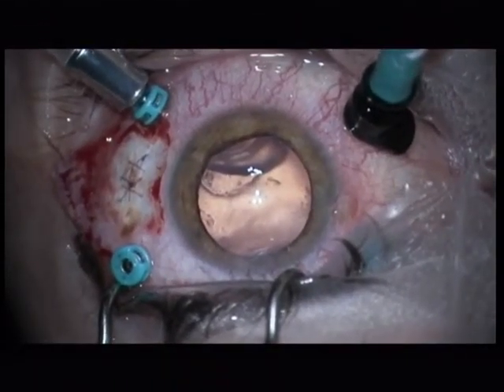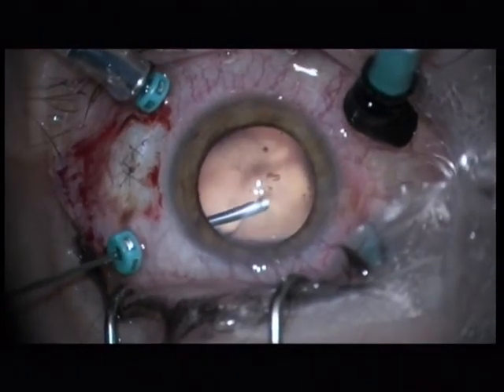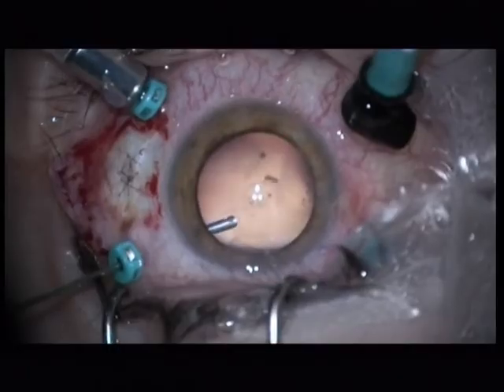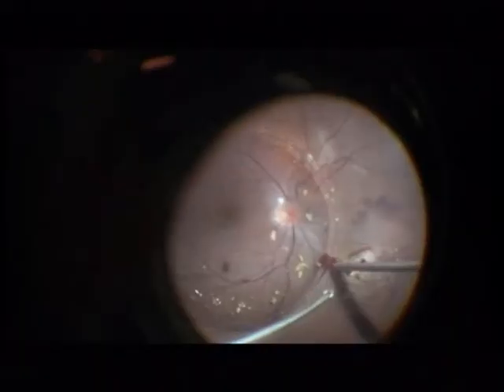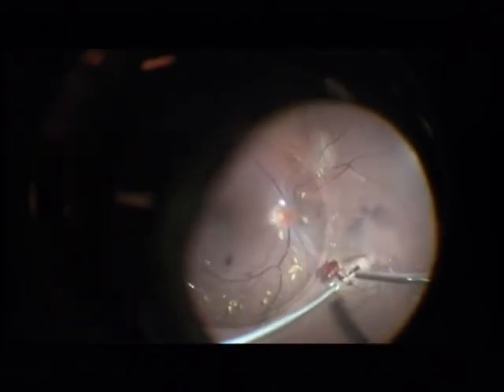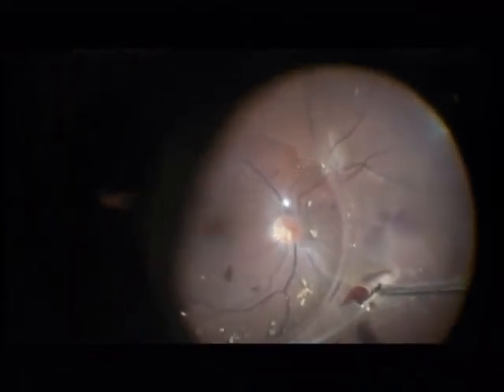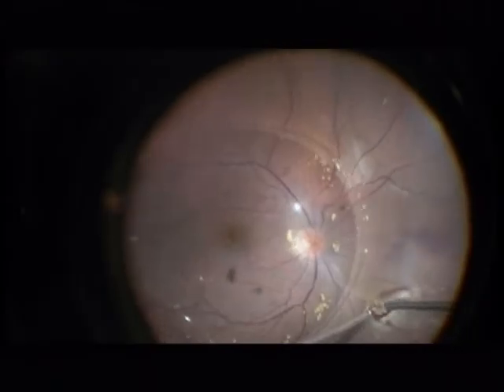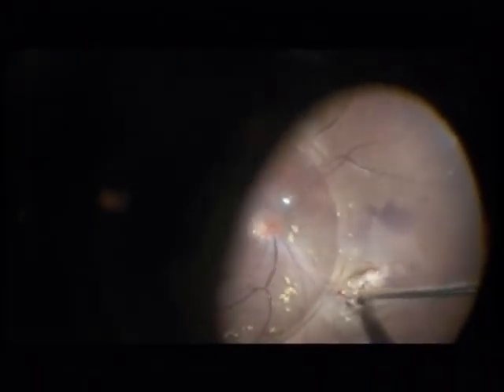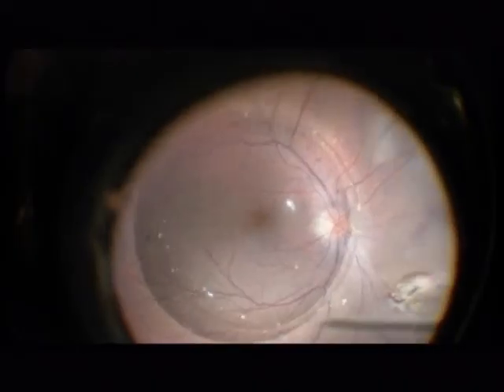Now we have to take care of the impact side on the retina. I remove first some vitreous with blood cells. This is the impact side — here is a slight hemorrhage. But you can see that there is no fresh blood coming from this big wound. The reason for this is that I waited 3–4 weeks for the surgery to prevent hemorrhaging and to prevent postoperative scarring and postoperative PVR detachment.